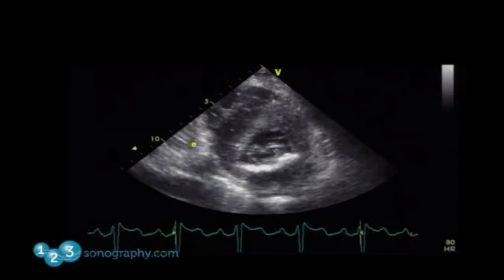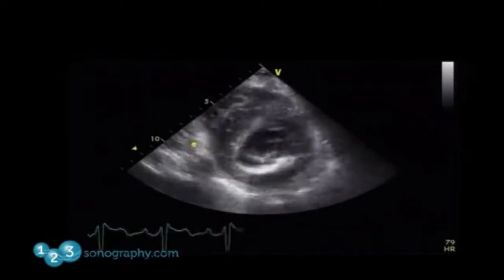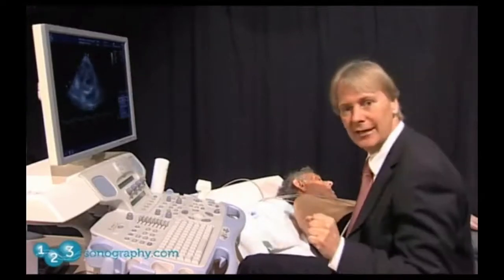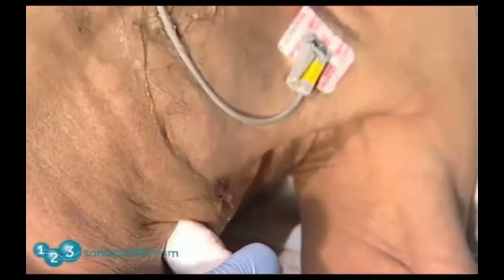So very difficult to see the contour. I don't know if I'll really take this for granted, but it will give me at least some clue as to what the opening area is, 1.5. Okay? So this is just some morphologic aspects. And now we'll do some quantification.